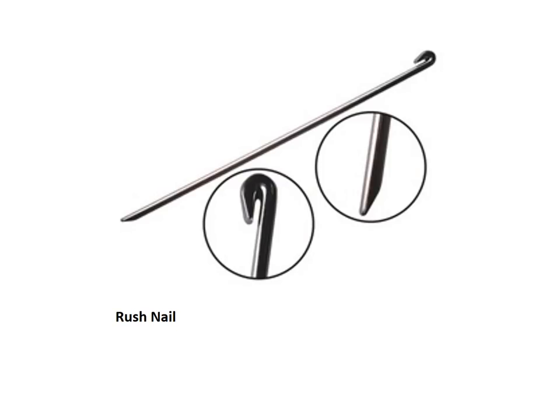Then we have a rush nail which is bent at one edge, which is used for fixation of the long bones, mainly in children, and the bent edge is there so that it stays along the cortex of the bone to prevent its migration into the intramedullary cavity.